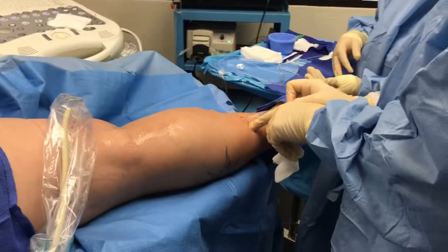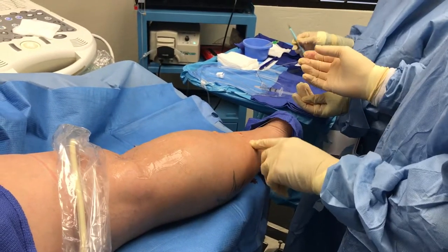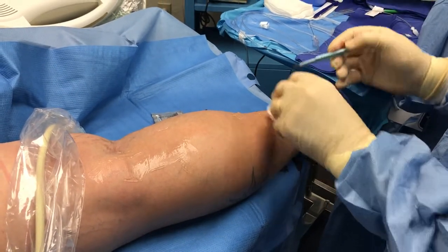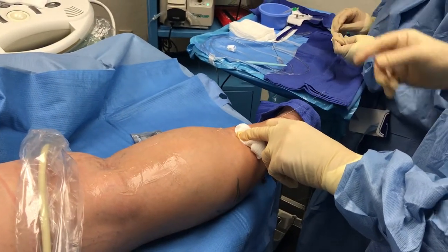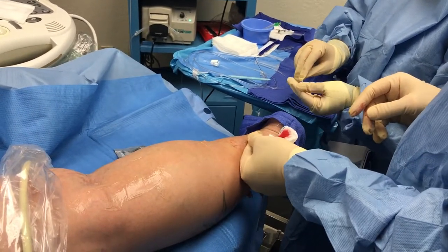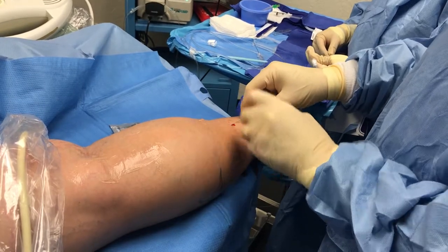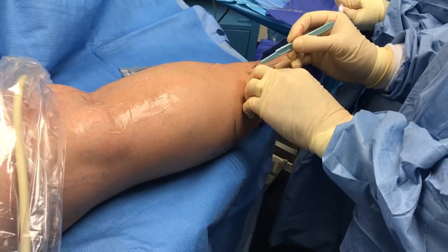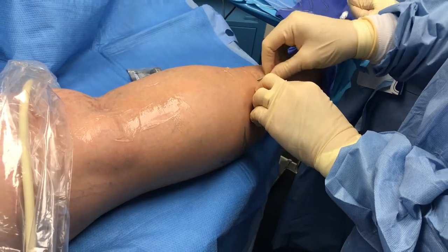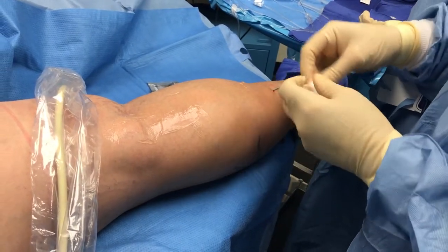We'll put some more anesthesia just in here and make a little nick with the skin. When we do this it's hard to get the catheter into the skin — the skin is relatively resistant. This catheter has a little external sheath and an internal obturator which eases its movement into the vein itself. So that catheter is now running up on the wire itself, so it can't really dislodge.